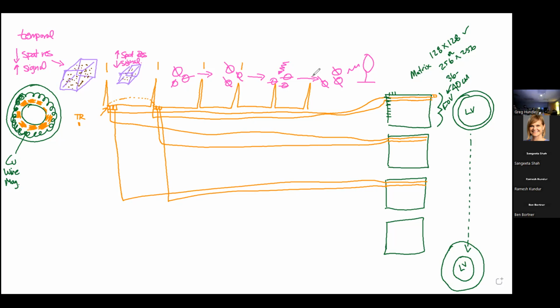And so you can take these TRs and group them, so that on this first frame, instead of one piece of information over this period of time, we've got a lot of different lines here, multiple pieces of information in that period of time. These are called phase encodes, and this is phase encoding grouping. So with the same overall interval of time, we have the ability to acquire multiple phase encodes.